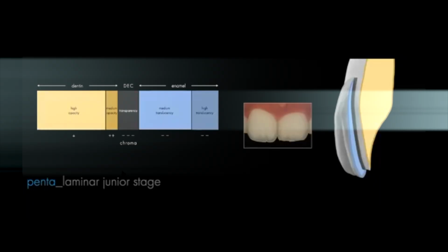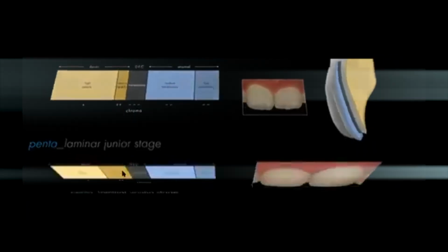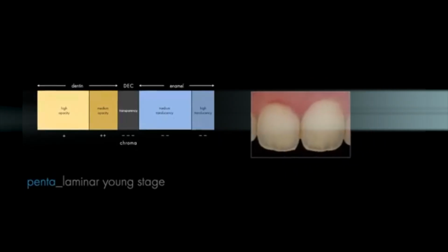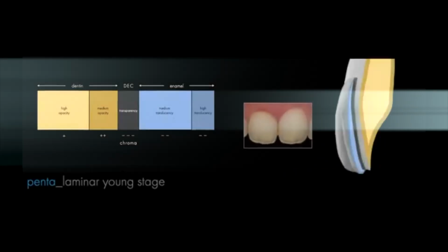The only problem is very often we don't have these very opaque shades available, and that's what limits us and what creates the issues of the grayish lines and grayish fractal lines and dark low value restorations. But if you have enough opacity, that's not an issue.